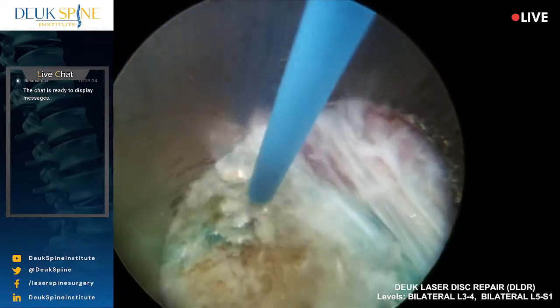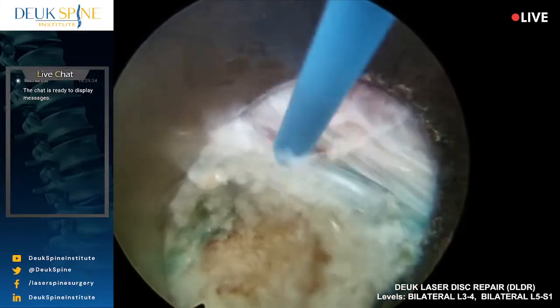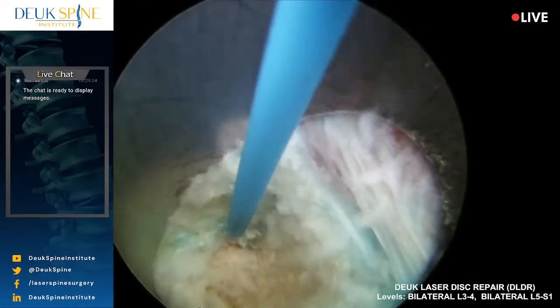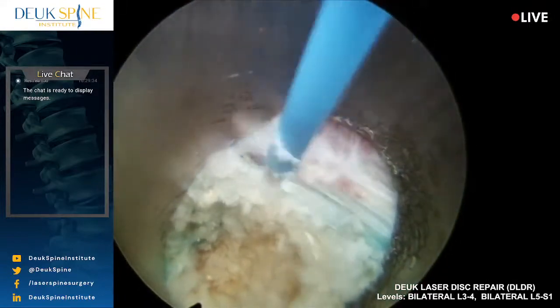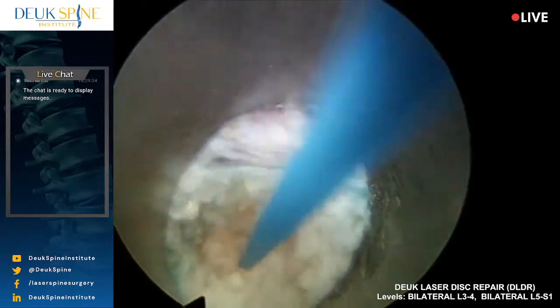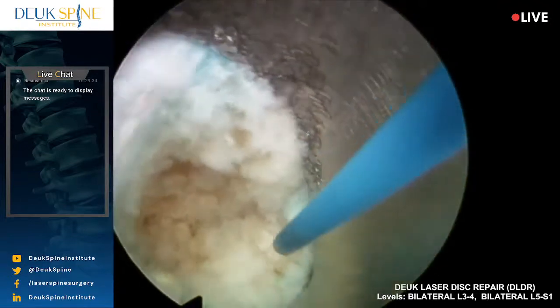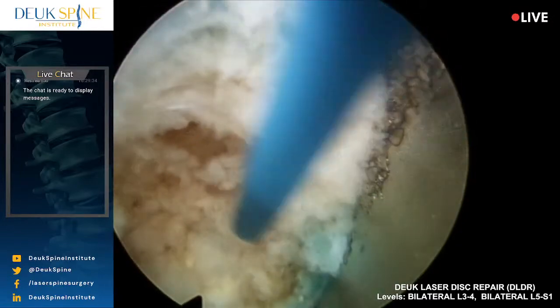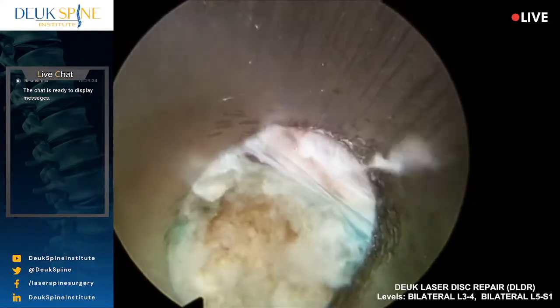Because you really can't feel the spine down there, and then you have to abort it. So I would say lower discs like C6-7, C7-T1, cervical spine, it takes the cake, especially in a thick-necked person. And then lumbar L5-S1, and thoracic if it's a really thick patient. A lot of extra meat, right? So those are the toughest areas.